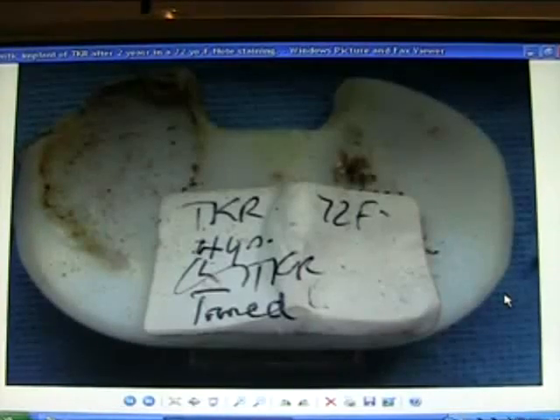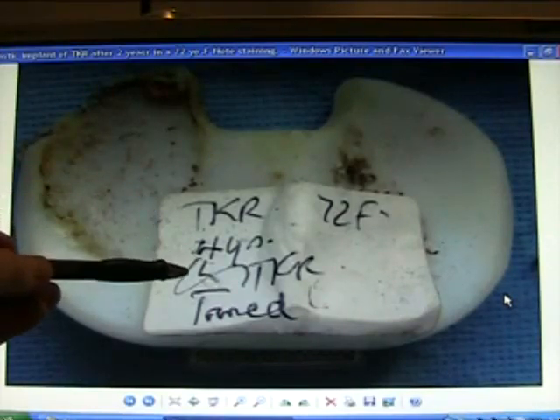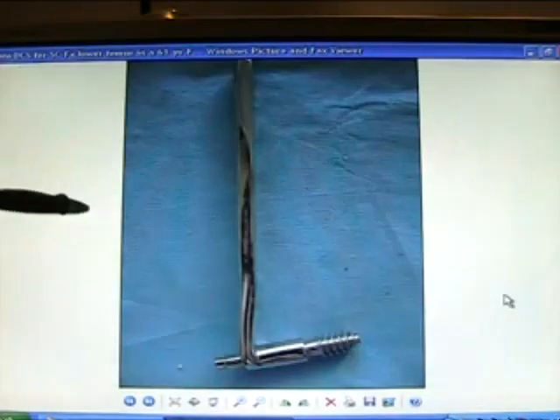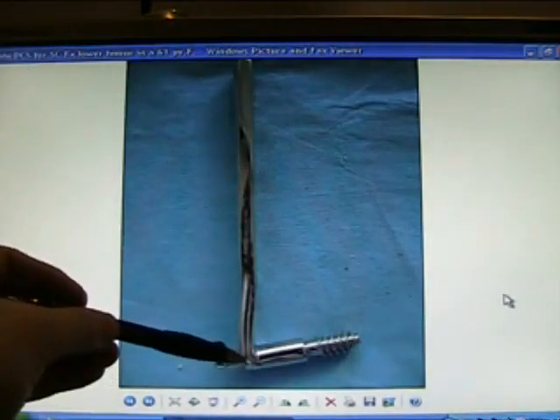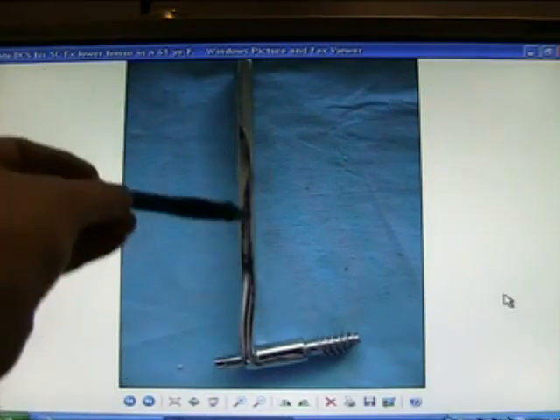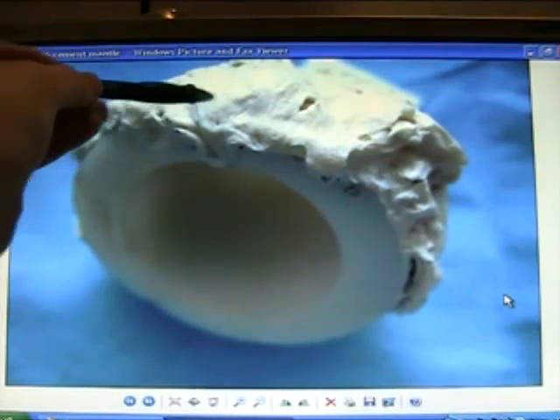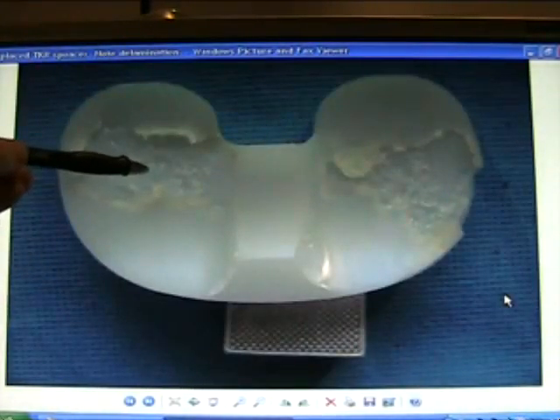Orthopaedics surgical implants and joint replacements, part two. Here we see a plastic implant of a knee replacement after two years in a 72-year-old. Look for staining. It's a blade plate for fracture of the lower end of the femur — supracondylar fractures of the femur. A polyethylene cup with cement mantle.